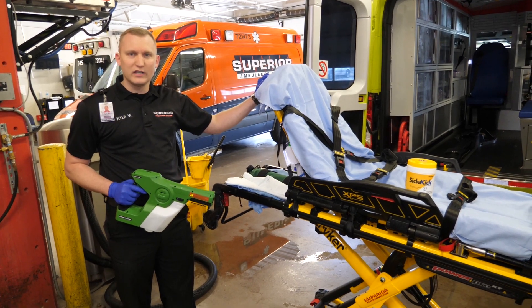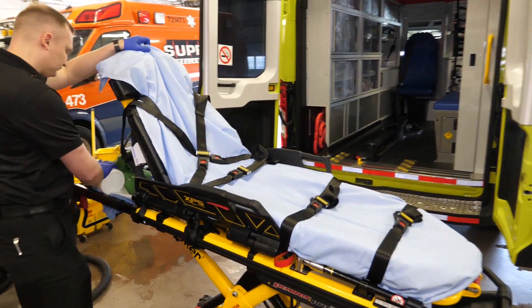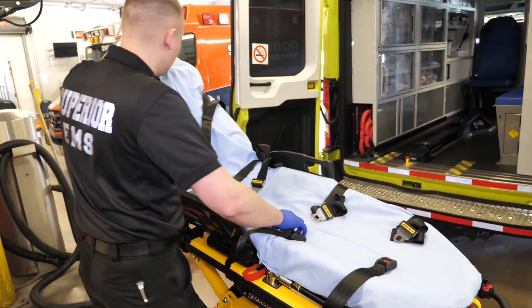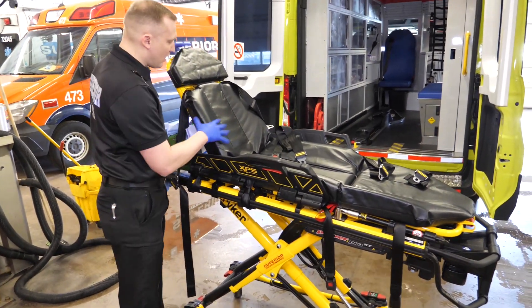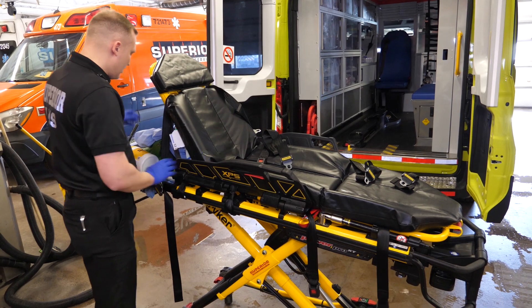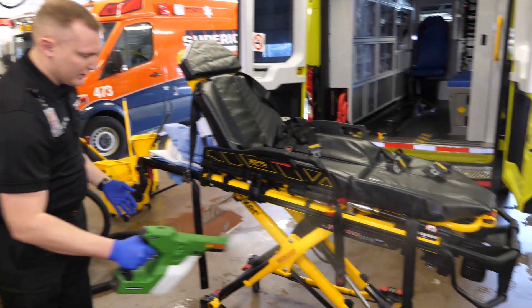Let's talk about the cot. When decontaminating the cot, we want to make sure that the sheet is not on the cot, so we're going to remove the sheet. We want to verify our cot mattress has no rips or tears in it. If it does, make sure that you see the logistics team to get a new cot mattress.